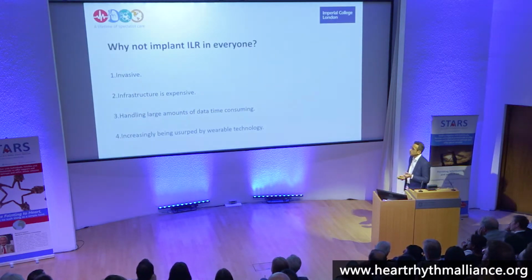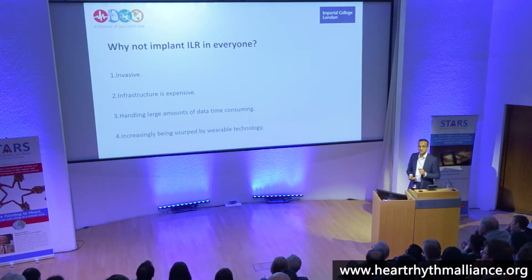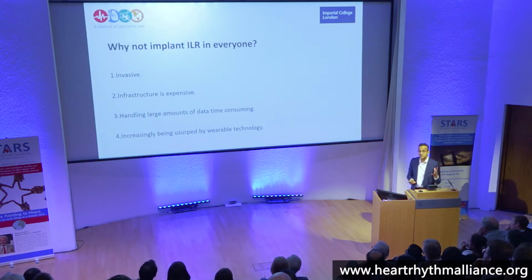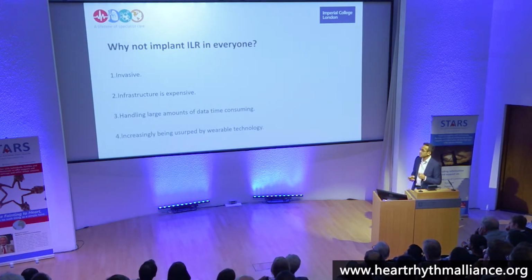So why not in everyone? Well, it is invasive. The infrastructure is expensive. The devices are not necessarily that expensive, and they can be put in almost anywhere now, even in a GP setting. But you need that infrastructure. The infrastructure can be expensive. We're handling a large amount of data. A lot of patients send us stuff, okay?